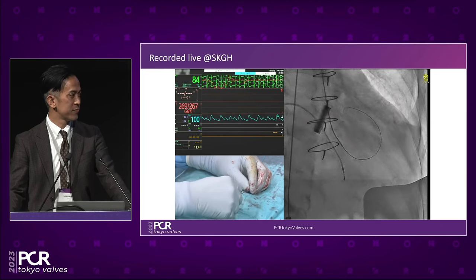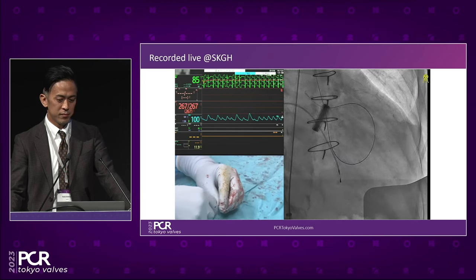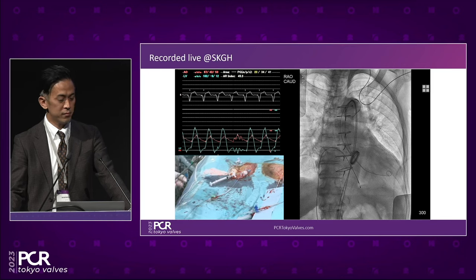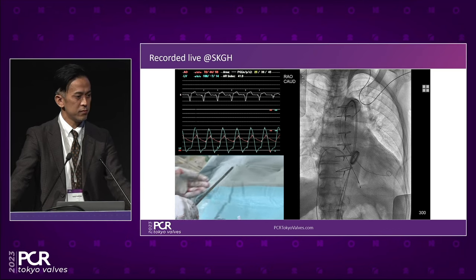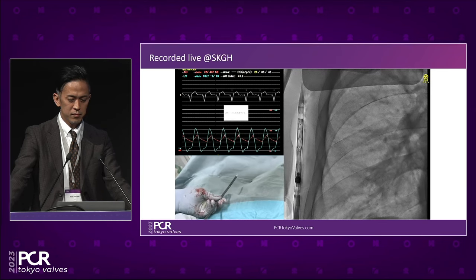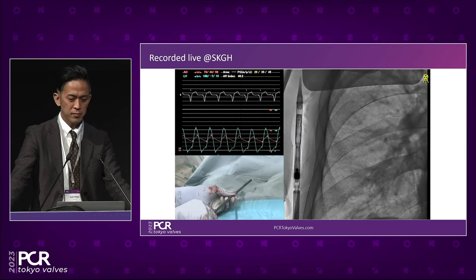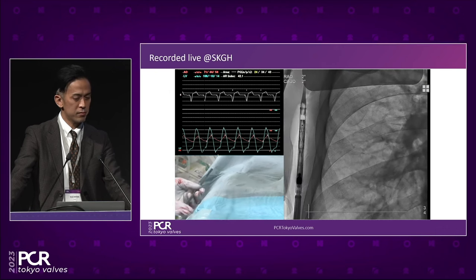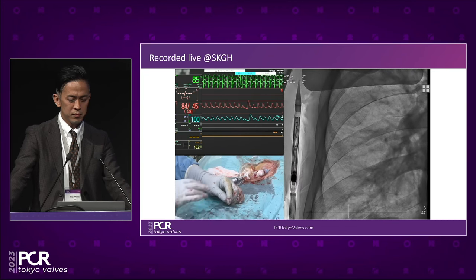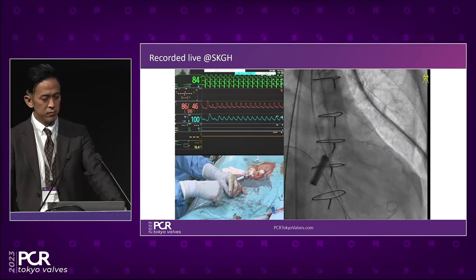So Michael, maybe for people who are not used to this procedure, what's the difference between LV pacing and RV pacing? Can you just explain it? Traditionally we were taught to put in the temporary pacing wire. You can either go from the femoral or from the jugular vein, so that you will have a temporary pacing wire inside. But actually, from our experience and from initial experience in France, you pace through the stiff wire that you use to implant your TAVI device, with the other end of the pacing lead over the skin, or for us, we sometimes do it over the coronary guide wire through the Sentinel device.